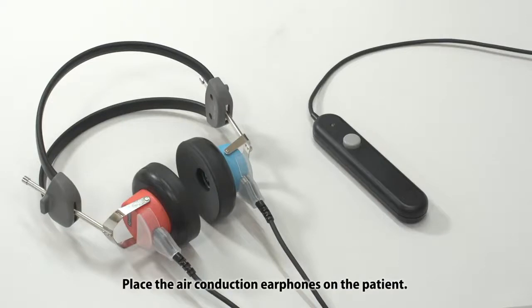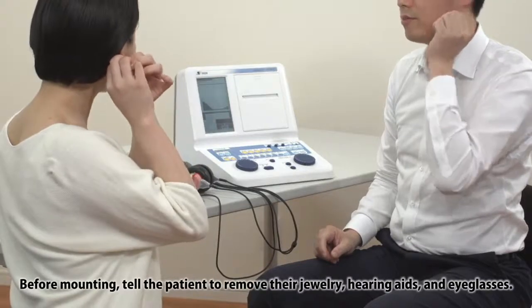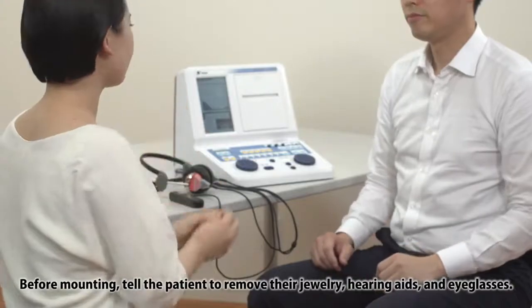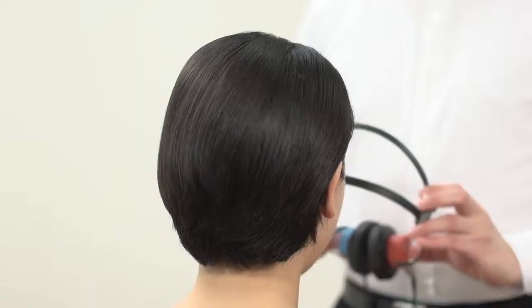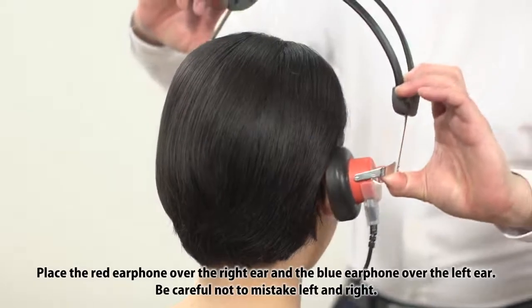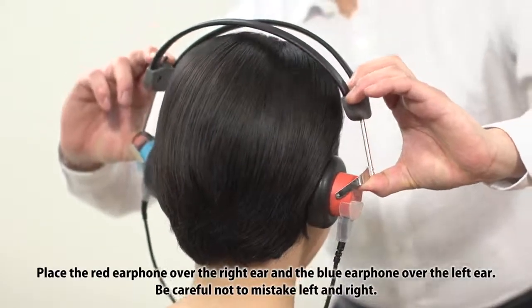Place the air conduction earphones on the patient. Before mounting, tell the patient to remove their jewellery, hearing aids, and eyeglasses. Place the red earphone over the right ear and the blue earphone over the left ear. Be careful not to mistake left and right.